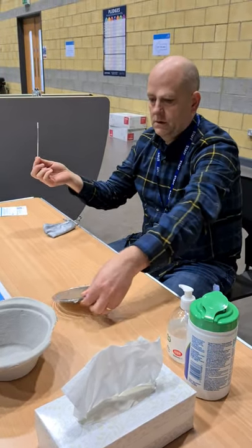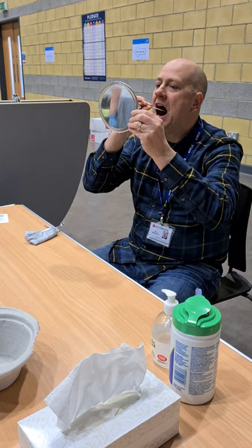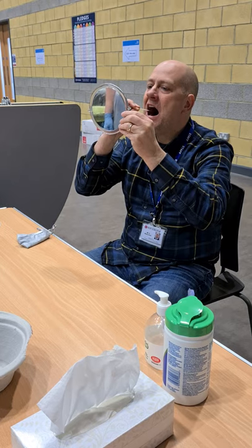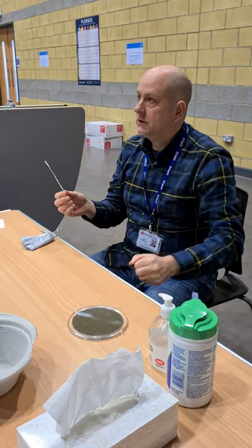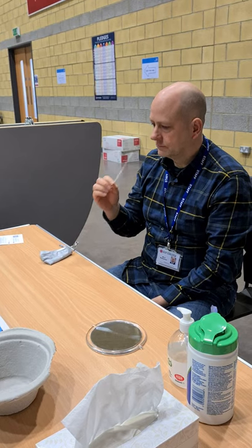Then I'll talk you through the nasal swab. Thank you. Now it's going up one nostril, as far as it will go, swirling it round five times for about ten seconds.